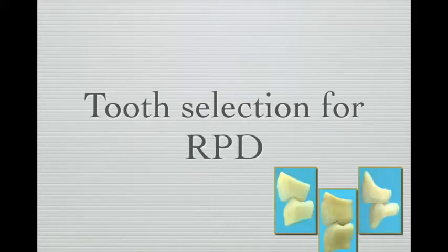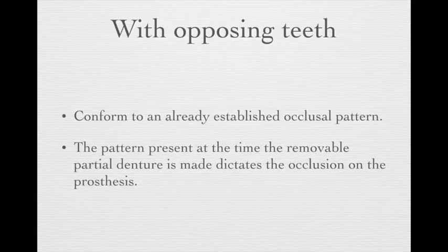In complete dentures, you'll already be told that we have three different types of denture teeth. We have non-anatomic, like 0 degree. We have semi-anatomic, like 10, 20 degrees. We also have anatomic teeth, like 30 or 33 degrees. So how do we select them for our RPD patients?